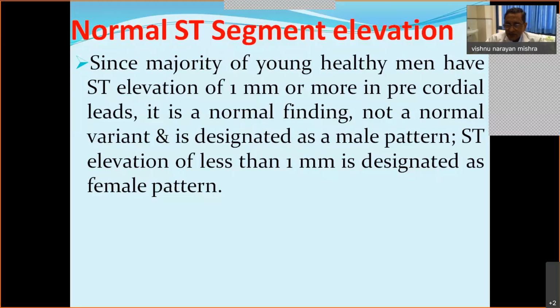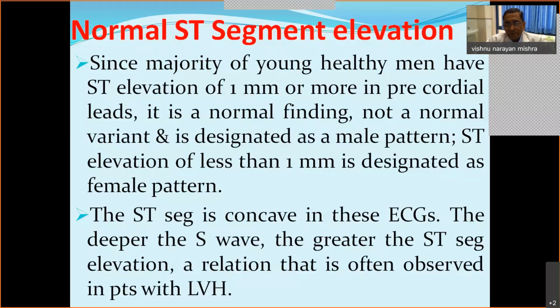The deeper the S wave, the greater the ST segment elevation, a relation that is often observed in patients with left ventricular hypertrophy as well. So the majority of young, normal, healthy individuals can have ST elevation in one or two of the precordial leads. And that is why this is to be kept in mind while interpreting ST segment elevation. This is again a diagrammatic and ECG representation of the ST segment elevation, which is normal.